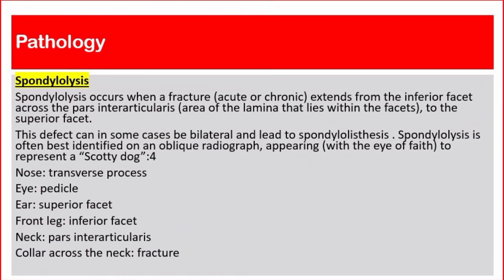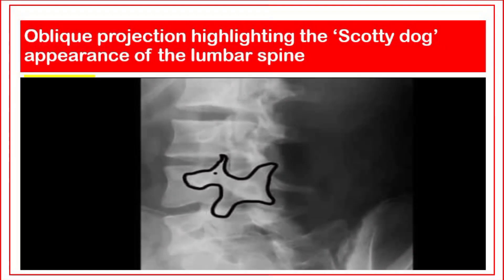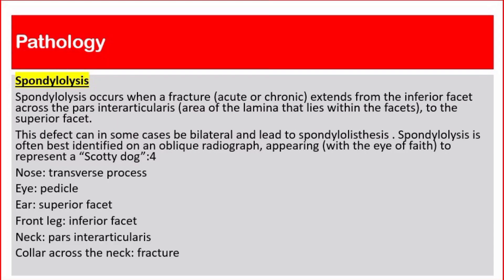The next pathology is spondylolysis. Spondylolysis occurs when a fracture, acute or chronic, extends from the inferior facet across the pars interarticularis to the superior facet. This defect can in some cases be bilateral and lead to spondylolisthesis. Spondylolysis is often best identified on an oblique radiograph, appearing to represent a Scottie dog. The nose is represented by the transverse process, the eye by the pedicle, the ear by the superior facet, the front leg by the inferior facet, the neck by the pars interarticularis, and the collar across the neck by the fracture.